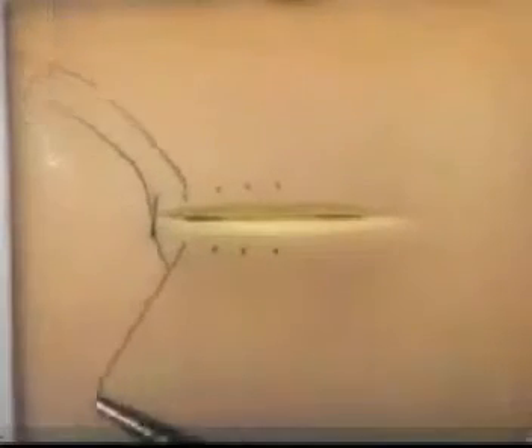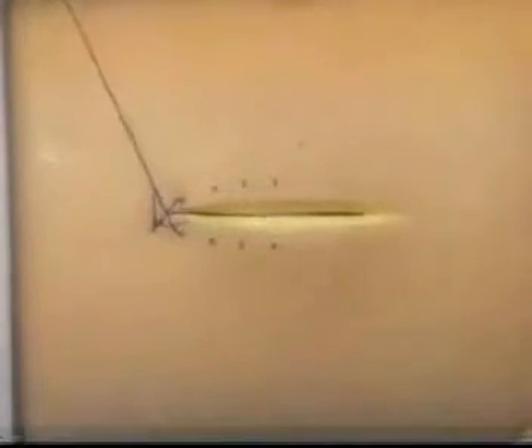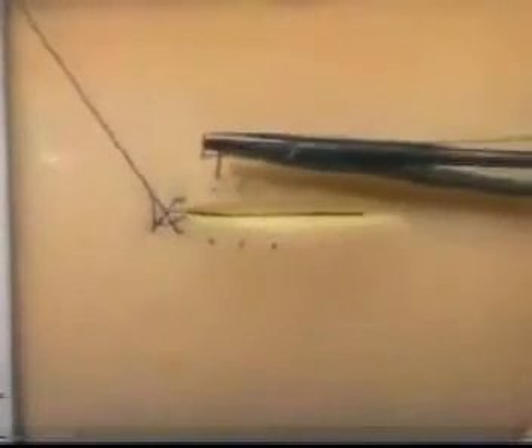Be careful when tightening sutures that the needle does not do damage outside your field of vision. When dealing with a long thread, don't simply pull the needle — use the middle finger of your right hand to grasp the thread, then use your closed forceps to take up further slack. Suture material can then be tightened without the needle leaving your field of vision. Your suture material is then passed to your assistant and the needle is available for your next suture.